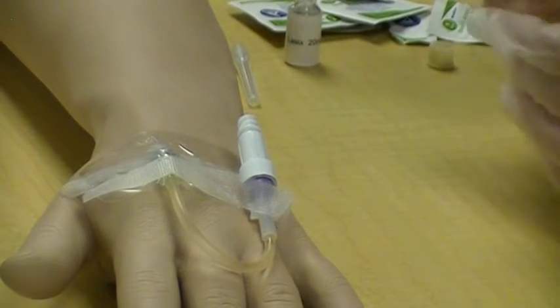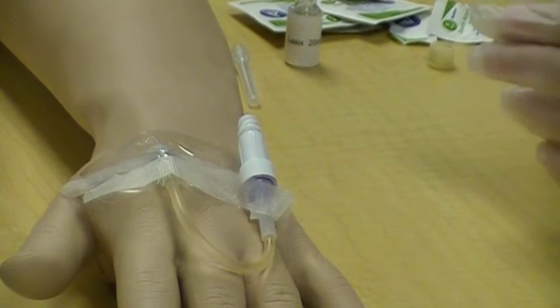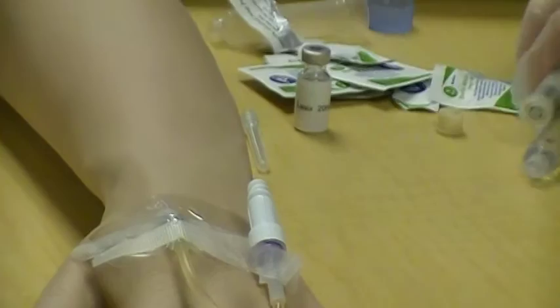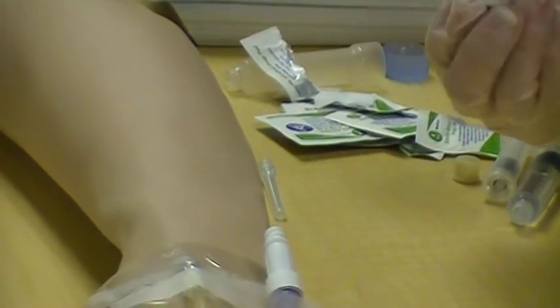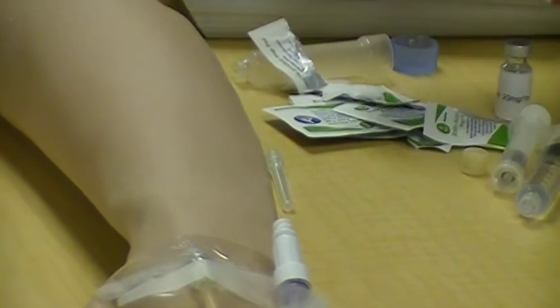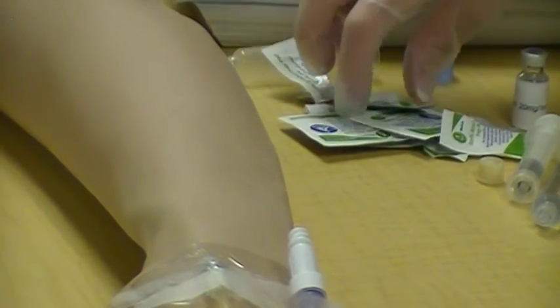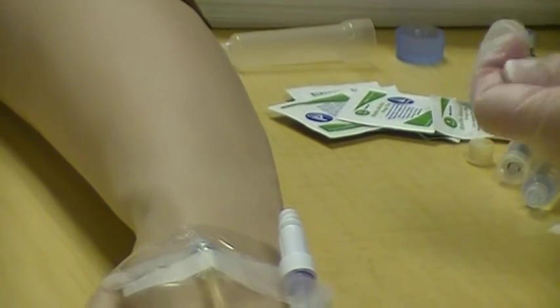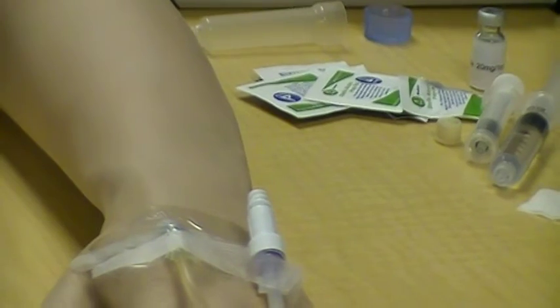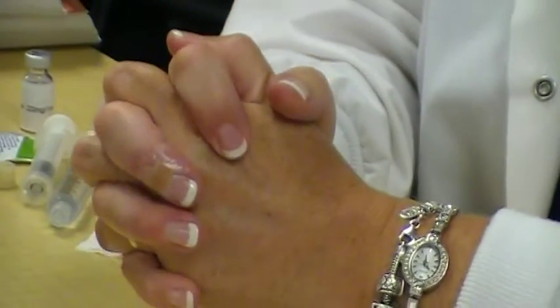So our saline flush and our medication syringe, those are going to go into the sharps. The vial, if it's glass, it's also going into the sharps. Unless it's a multi-use vial, then we would keep it for further use. Any kind of needles would also go into the sharps bin. Our alcohol preps, we're going to take that and take our gloves off. We're going to wash our hands, and then we're going to make sure that we document.